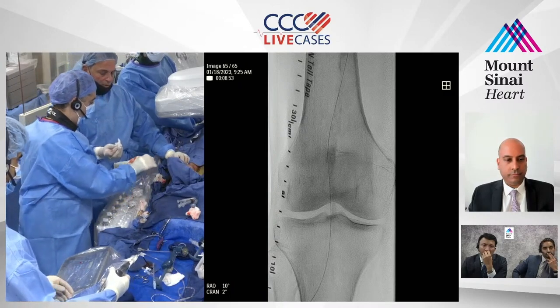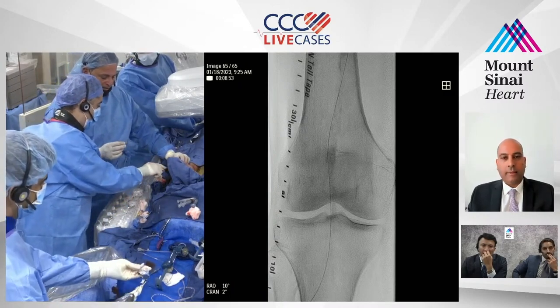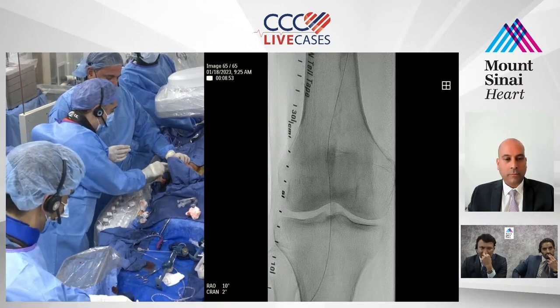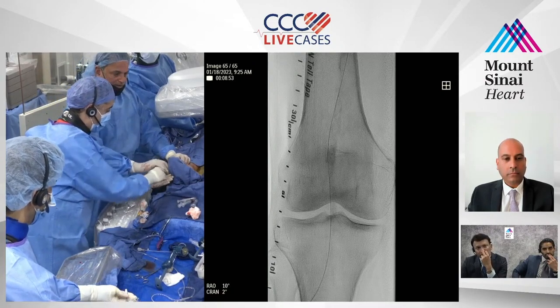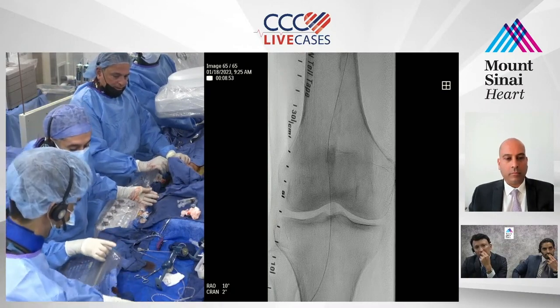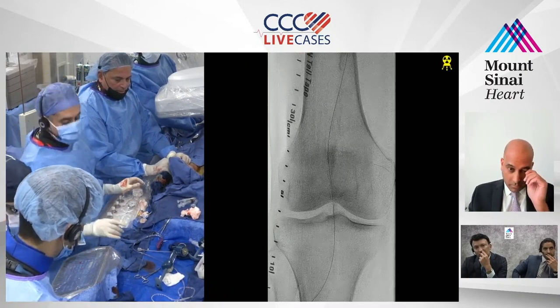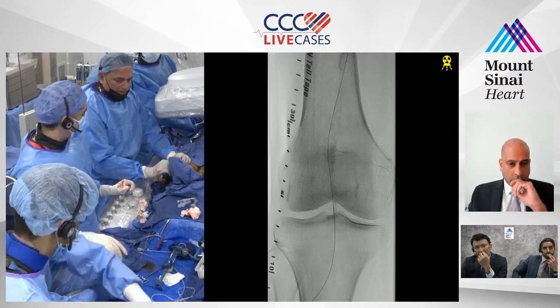So now we're going to go over the wire here, which is going to allow us to exchange the wires as soon as we cross this and do a couple of shock waves. So the wire is not going to be there. We're just going to keep the system straight. Do we have the wire? No wire. System straight. Okay. It'll come up. You got to walk with me, guys.